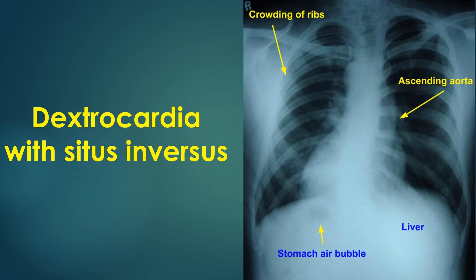There is mild scoliosis with convexity to the left, which could be partly positional. Crowding of the upper ribs on the right side could be due to scoliosis.